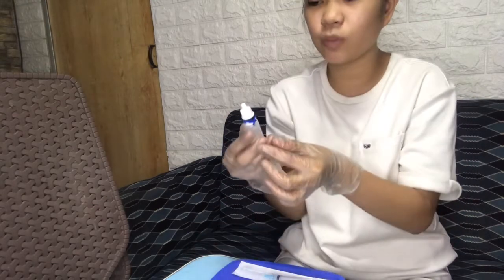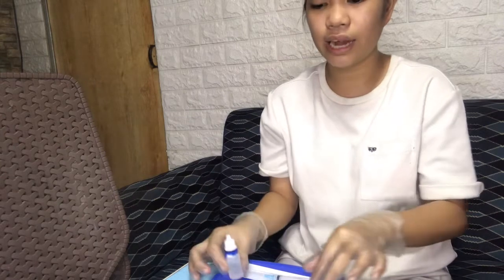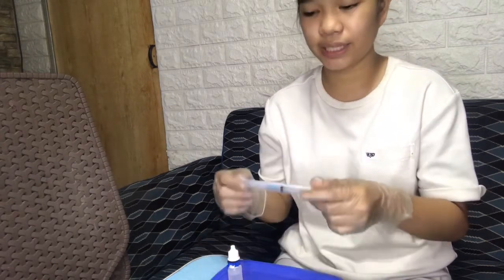So let's just pretend that this is my vial. Next is the cotton, or the antiseptic wipe, and lastly this is my syringe. So mix the solution in the vial if necessary by rotating the vial between the palms of my hands, not by shaking. So I'll be rotating this between the palms of my hands.